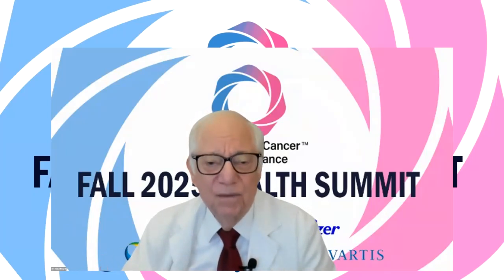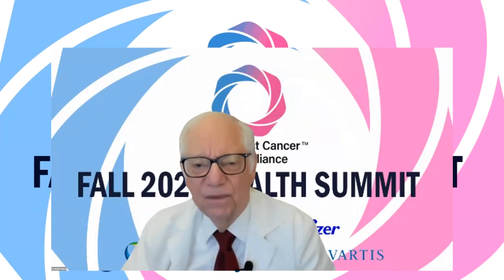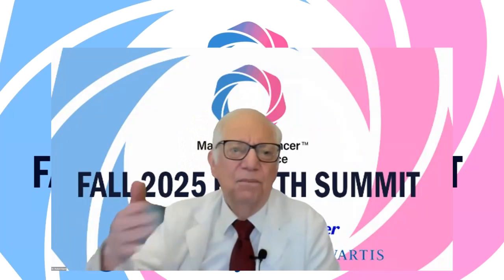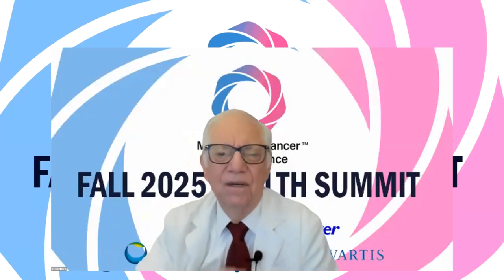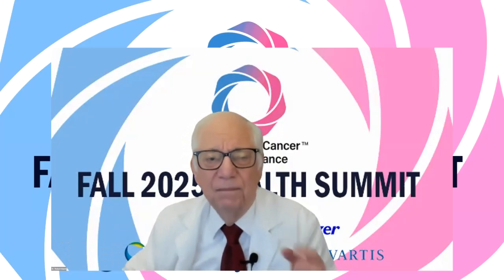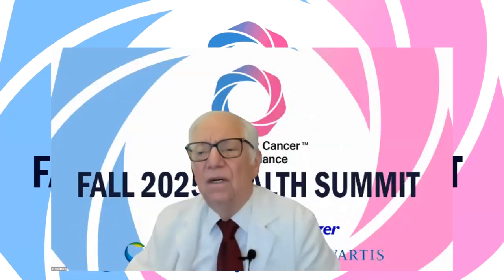So men, don't worry about going into a mammogram facility with 50 women looking at you. You're not alone. There are ways to do it in the office. We sent these out to firefighters. There are portable ultrasound units that can go and you can put the thing on the breast and see if there's something bad going on. We did this during the COVID era when everybody was locked down. We did this for the firefighters. So all this is available.